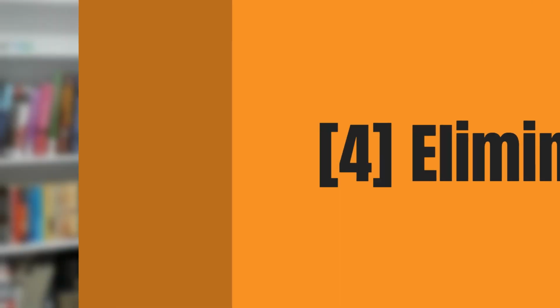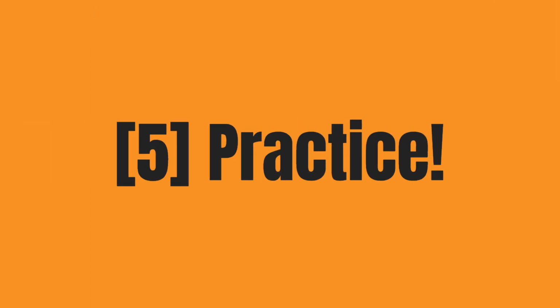Okay, so let's do something different for this point. One thing that's always useful, if you are struggling to identify a cell, is to tick off the things that it is not. I use elimination quite a lot, especially when it comes to some of the more complex cells.